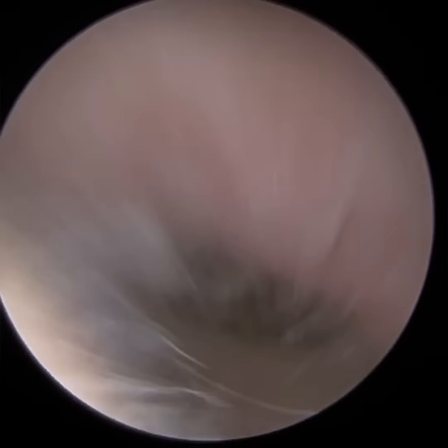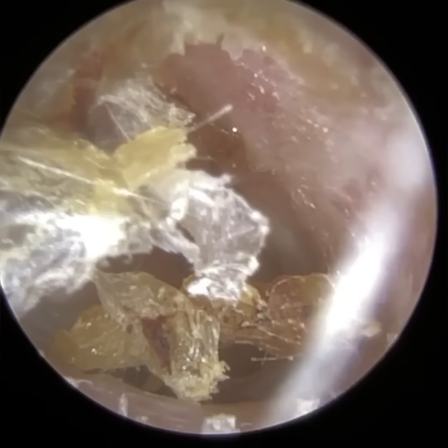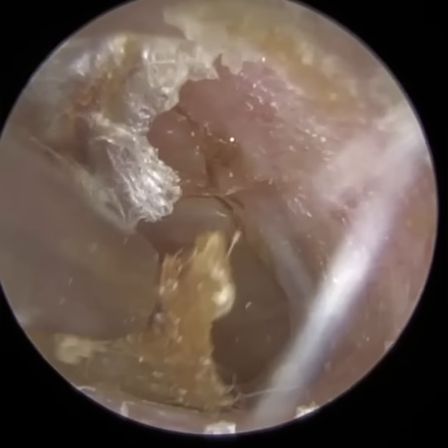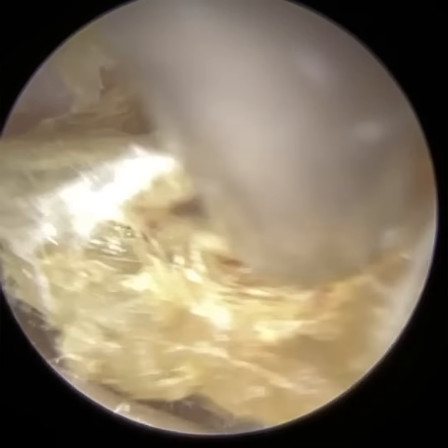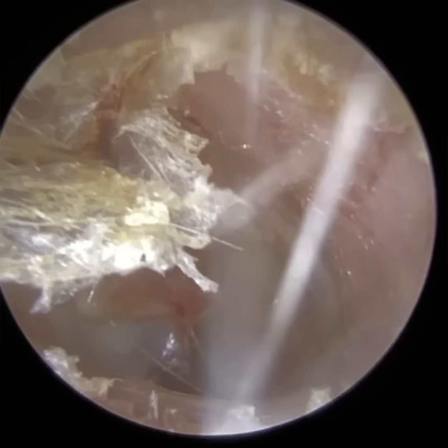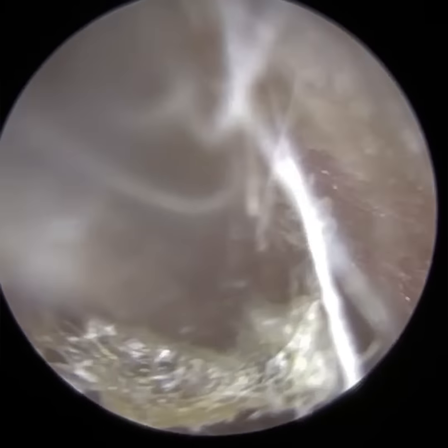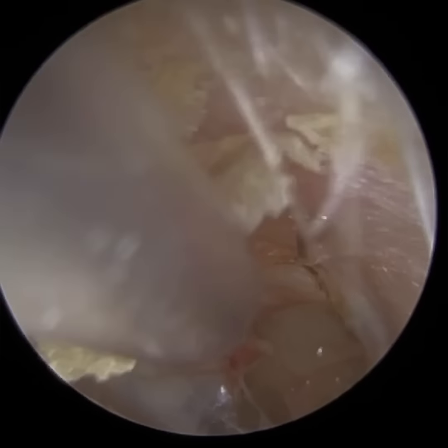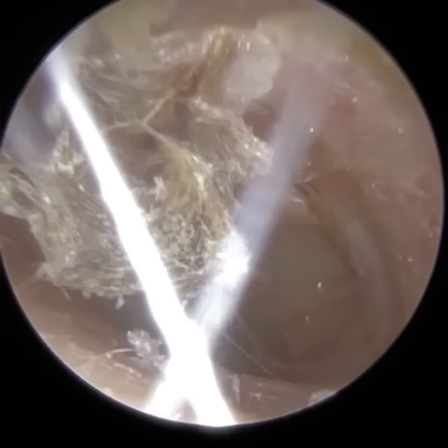But when you've got a hole in your eardrum, it's going to disrupt that migration because obviously there's a huge piece of the eardrum missing. And quite often you can get dead skin that then collects on the eardrum. It can happen with ventilation tubes, grommets as well. I have one patient that attends every month just to have dead skin removed off the eardrum. I've uploaded plenty of those videos on my YouTube channel in the past. That's because the grommet is preventing the migration. Some of the skin still attaches to the grommet. So you can just see how dry, crusted this is.